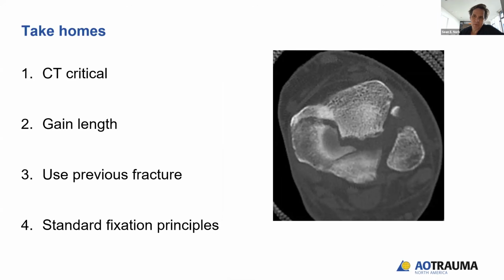Yeah, so I did the bulk of the work through posterolateral and posteromedial approaches, but then I also added a third small direct medial right over that component of it to free it up and to put in an osteotome right along that line. So that exit point at the anterior aspect of the medial malleolus. Yeah, so I had to have osteotomes in 3 different locations: through the fibula, cranial to caudal, and directly medial. So I think the take homes were that the CT scan's critical, and gaining length, even sometimes if it's 2 weeks, can be really challenging in these fractures.